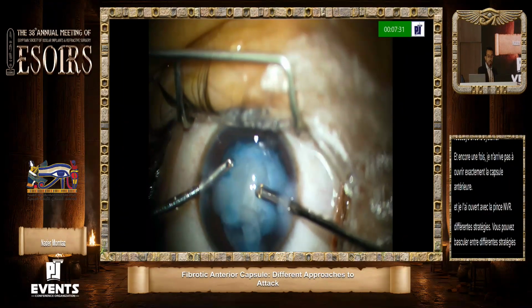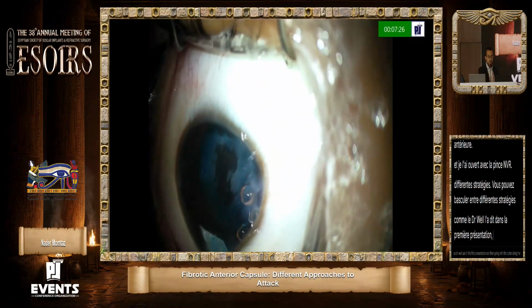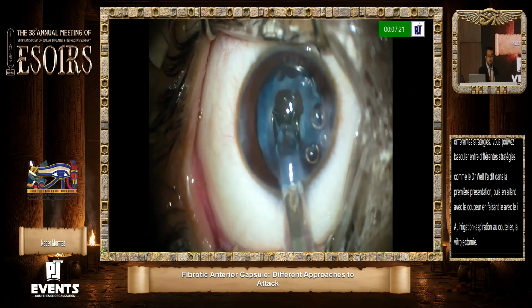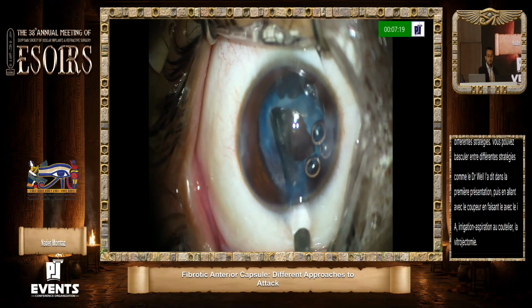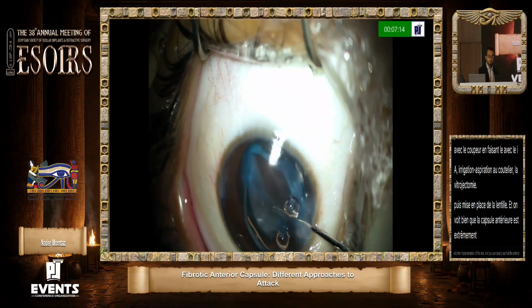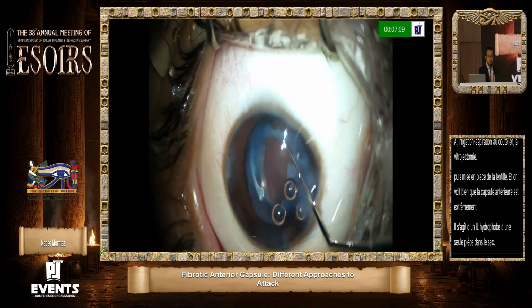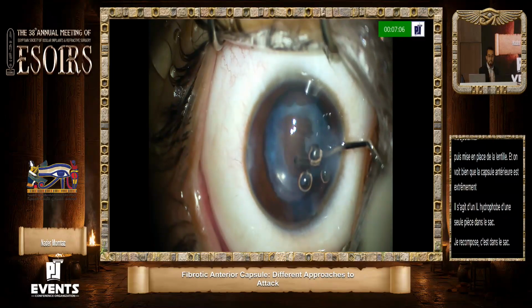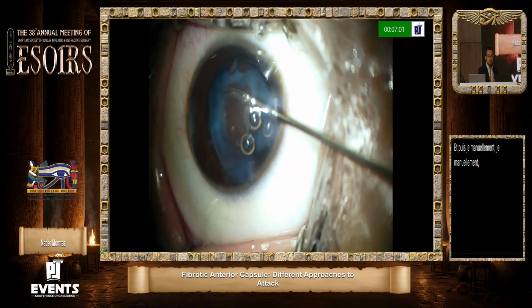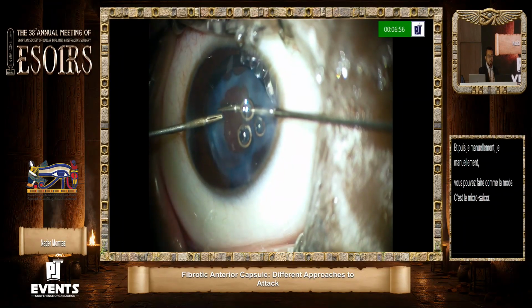And then going with the cutter, doing the IA, irrigation aspiration with the cutter, the vitrectomy, and then implantation of the lens. You can clearly see that the anterior capsule is extremely fibrotic. This is a hydrophobic single piece IOL in the bag. Redialing it in the bag, and then bimanually you can do fashioning. This is the micro scissor. It can be used inside the eye in cataract surgeries along with retinal surgeries.